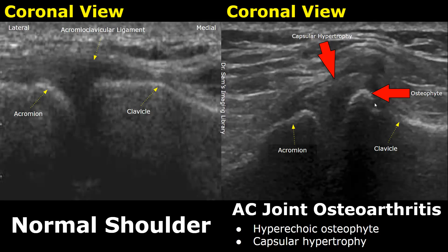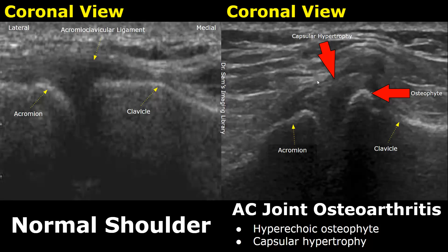In this image we have AC joint osteoarthritis. The joint space is filled with hyperechoic osteophytes, and there is also capsular hypertrophy — we see a thick joint capsule, whereas in the normal joint this type of thickness is not seen.